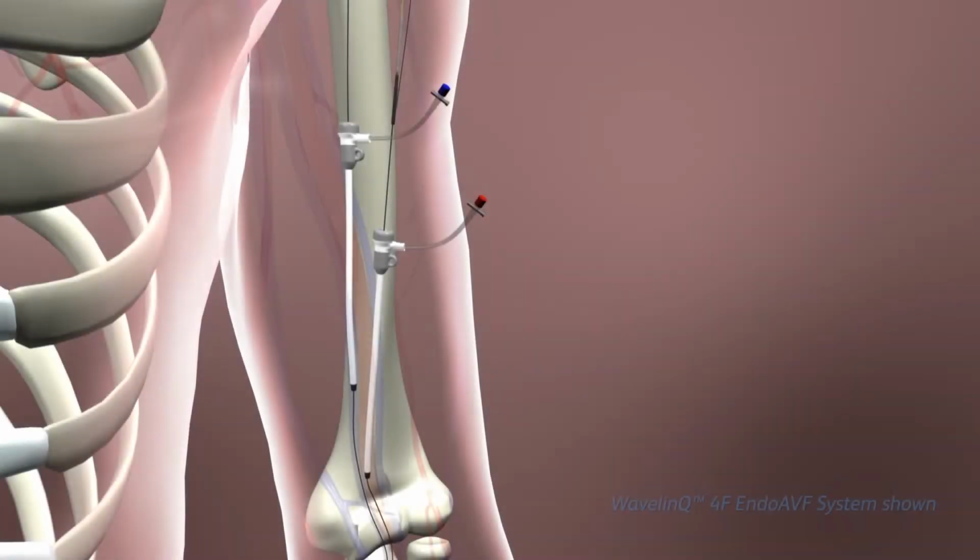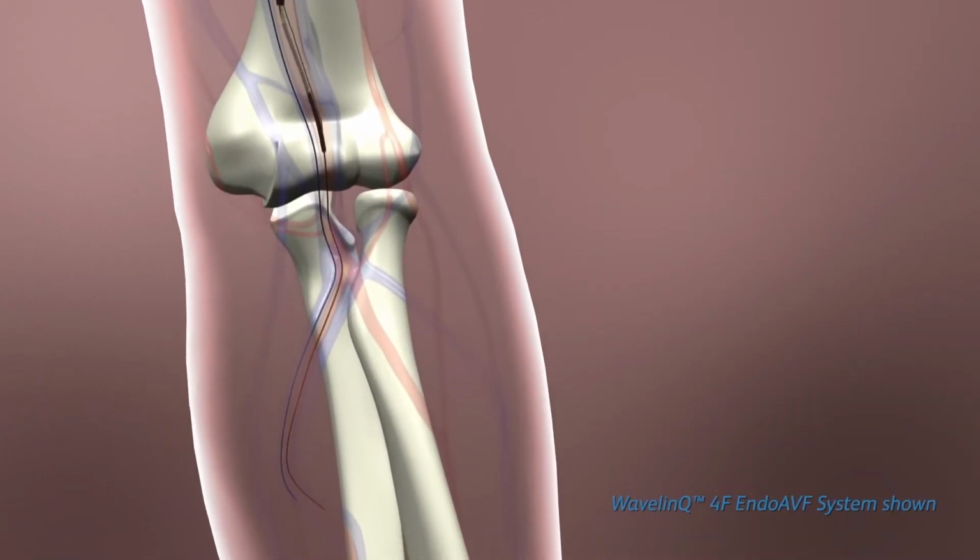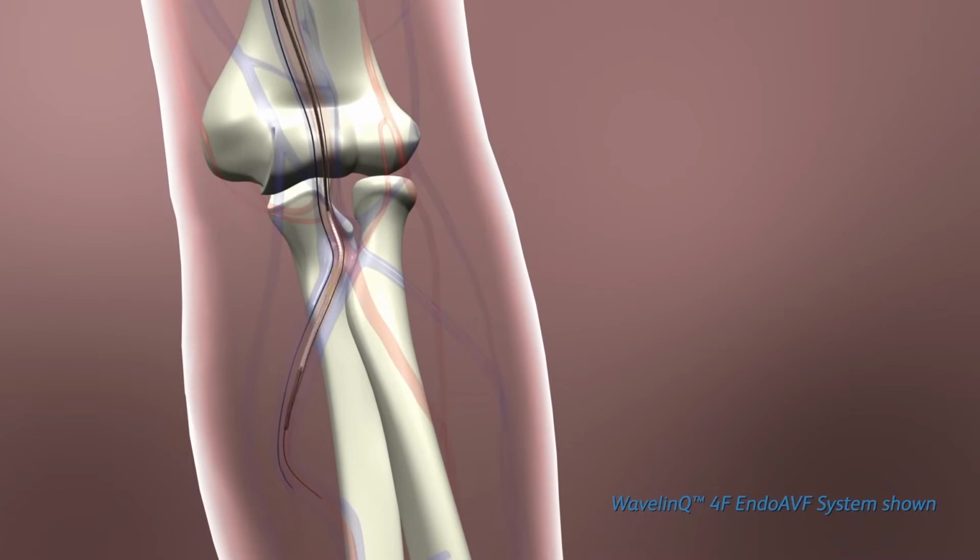The WavelinQ 4 French EndoAVF system is designed to give patients a versatile endovascular AV fistula creation alternative to open surgery. Using two thin, flexible, magnetic catheters and a burst of radiofrequency or RF energy, physicians can create an endovascular AV fistula. In order to create the EndoAVF, the physician inserts two thin, flexible magnetic catheters into an artery and a vein through a small puncture or incision.